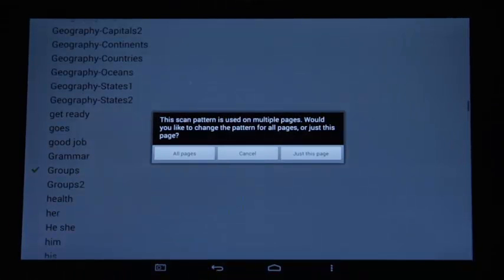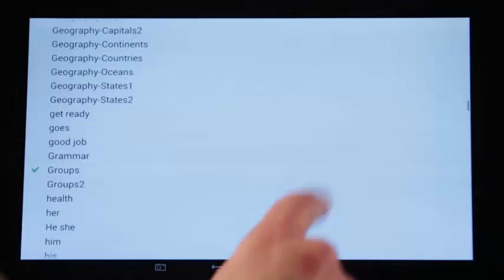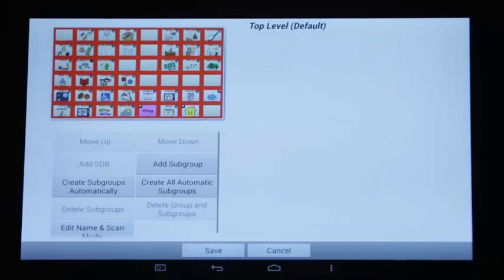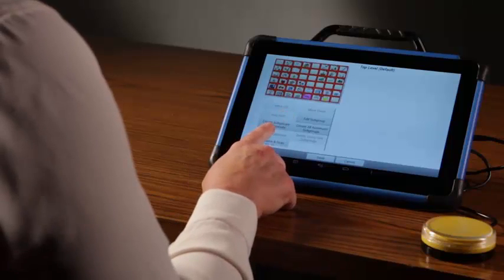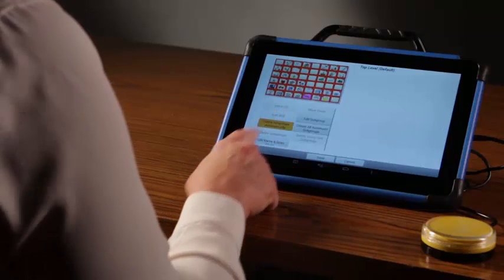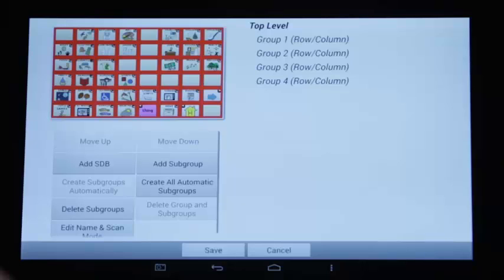Our options appear to select all pages, cancel, or just this page. I am only customizing this page, so I select just this page. A preview of the page appears and I am able to see what areas I am creating the custom scan for. I originally set up the scanning pattern to be block in our settings. In this example, I will create subgroups automatically to allow the software to set up the blocks following the system settings. I will create meaningful new labels for the blocks. Tap Groups.